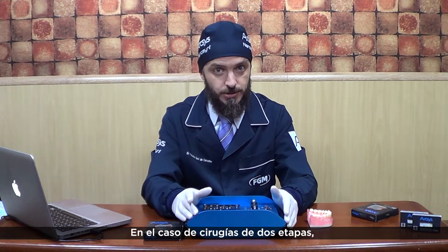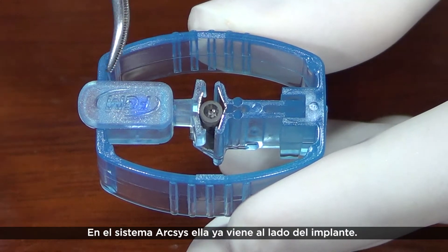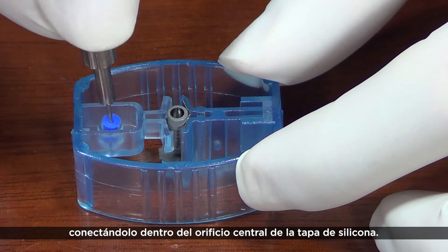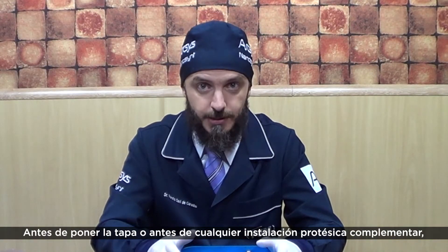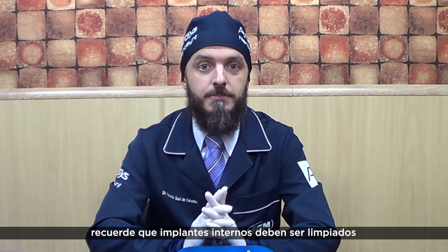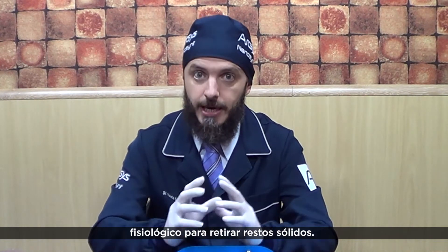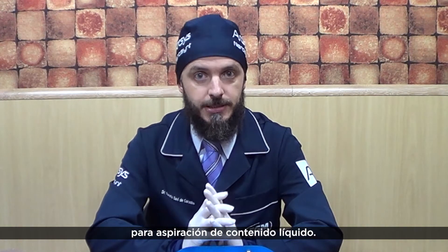In case of two-stage surgeries, the implant must be protected by the silicone cover. In our system, it is offered beside the implant under this plastic sheet. For easy installation, use the cover inserter, connecting it into the silicone center hole. Before covering, or prior to any prosthetic component installation, remember that the internal implant chamber must be cleaned and dried as much as possible. Perform a vigorous washing with saline solution to remove solid debris, then use a slender endodontic cannula for liquid content aspiration.